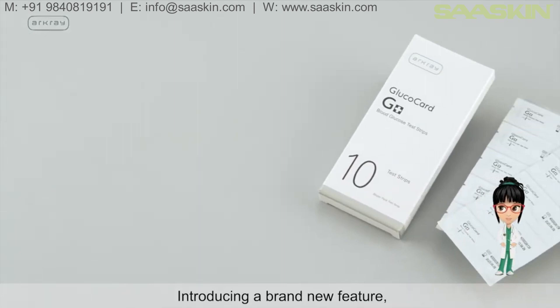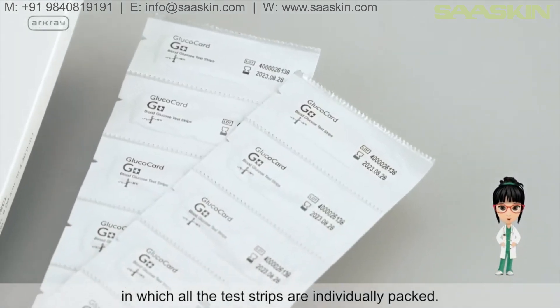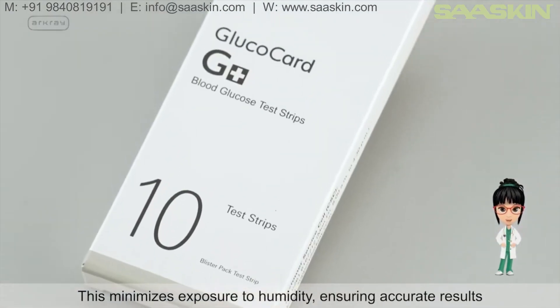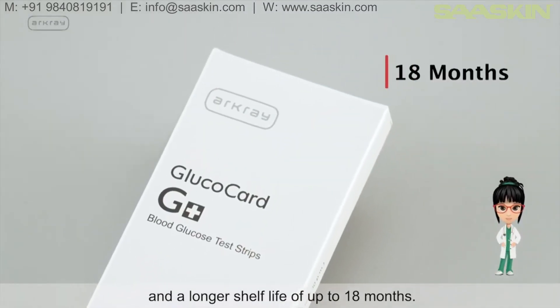A brand new feature: all test strips are individually packed. This minimizes exposure to humidity, ensuring accurate results and a longer shelf life of up to 18 months.